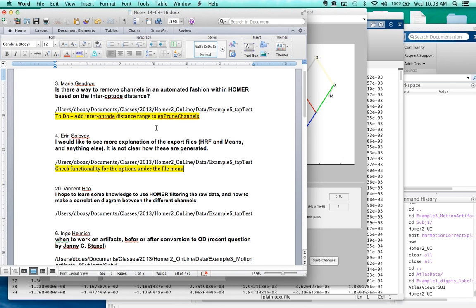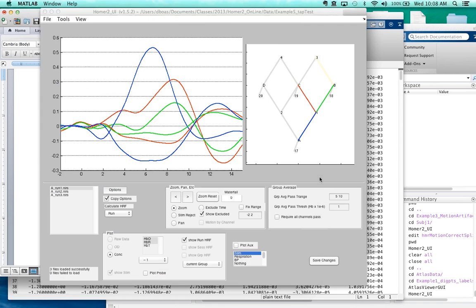Okay, so I just had a question. So that will just basically export exactly the plot that you see there, and the values, no processing done to it, just whatever was done. That would be good.